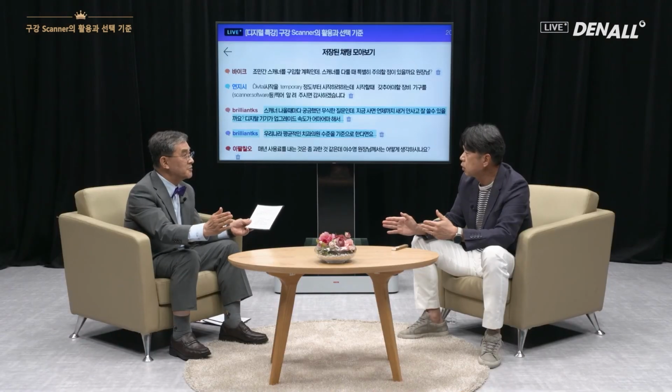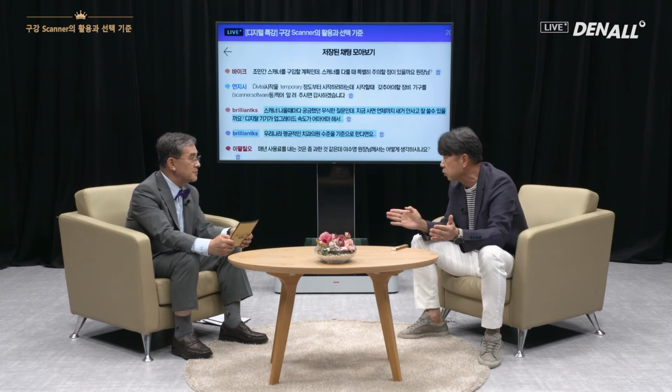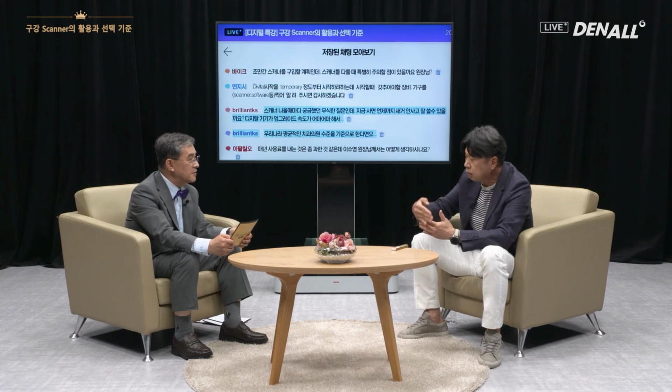Let me take an example. If you bought a car 10 years ago, do you need to throw it out now? New cars come out every month, faster cars, new style cars. And I bought a car 10 years ago, and it is still satisfactory. You can continue to use it. You can drive it up to Busan, right? Yes. For the purpose, if it is satisfactory, you can continue to use it. The same is true for the scanners. If it is no problem in creating crown bridge and others, no need to change them.